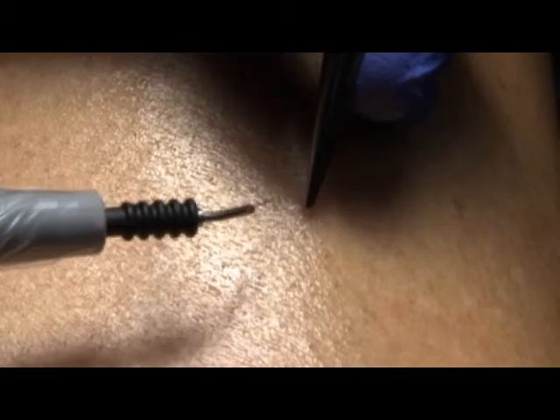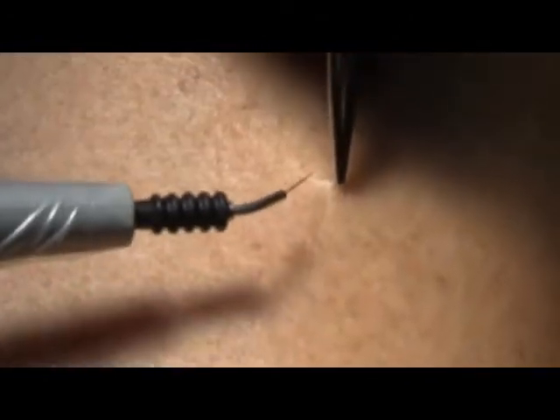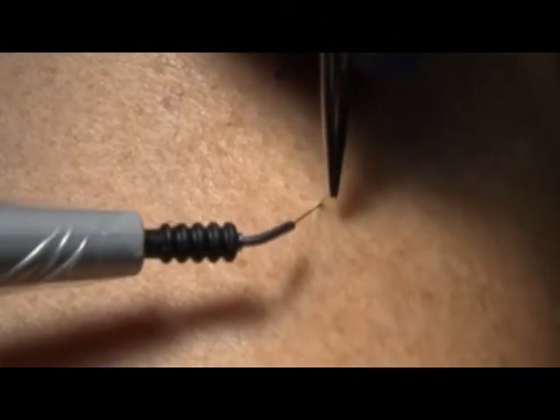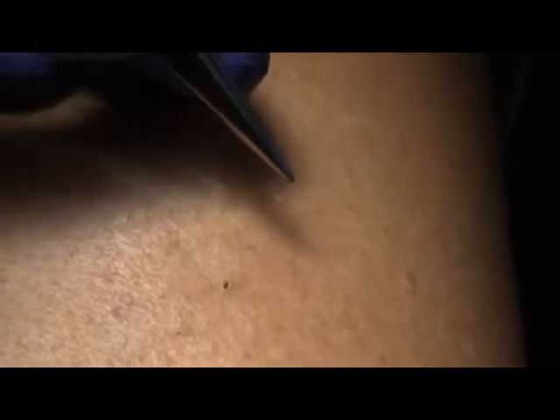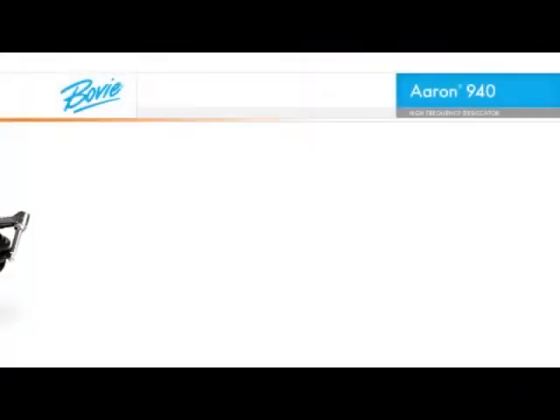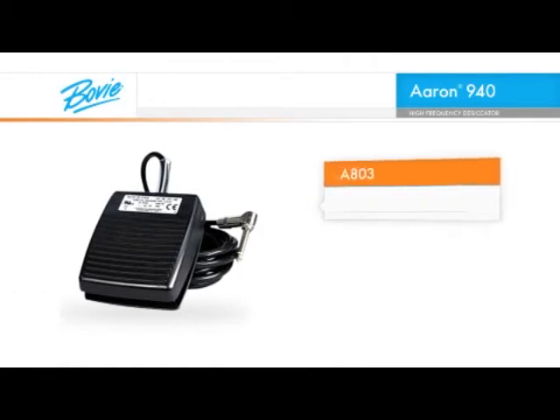Insert the epilation needle into a test follicle in the area you will be treating. Your patient should feel no pain or minimal discomfort with a proper insertion. Insert fully to the depth of the hair at the angle of the hair growth, being careful not to pierce the follicle. Avoid shallow insertions, since this may cause the current to miss the papilla, reducing effectiveness. Now, activate the handpiece for just a few seconds for each hair.